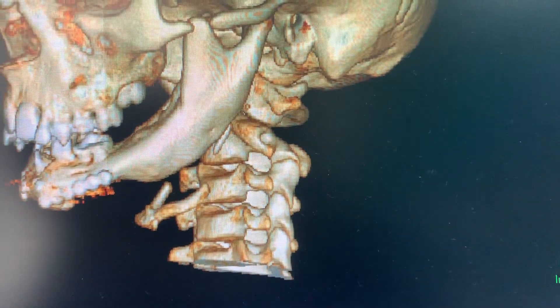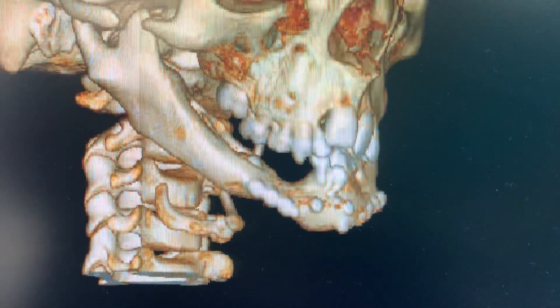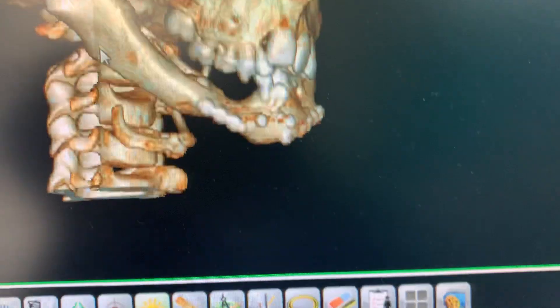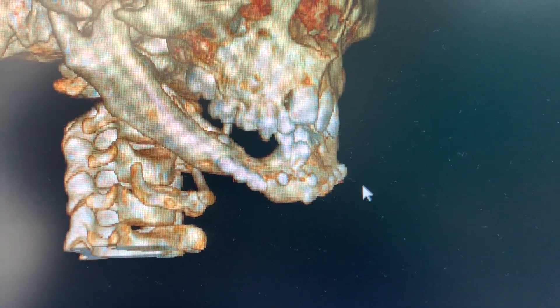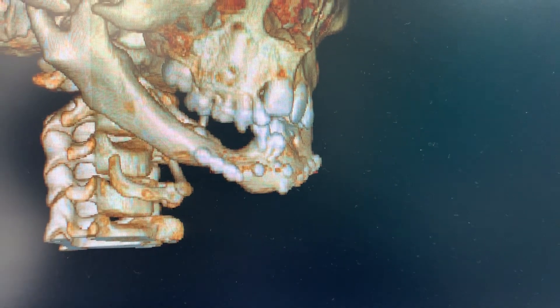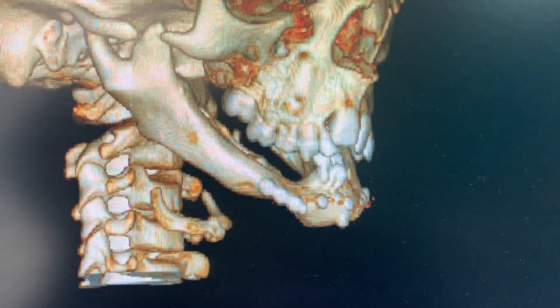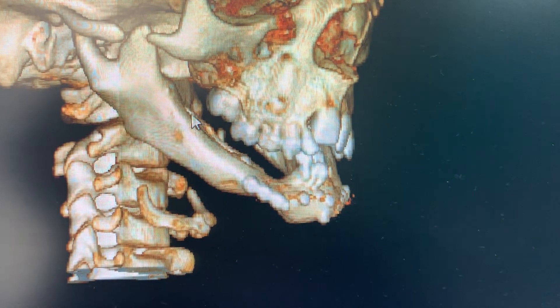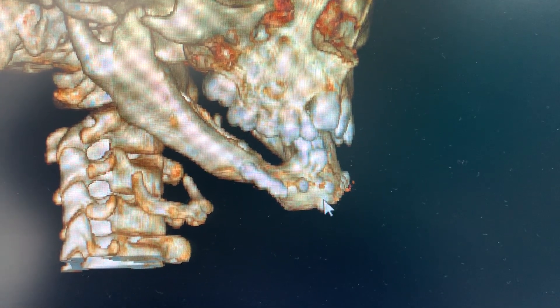I'm planning to do intraoral distractors. You can see how the coronoid and the condyles are, and the gonial angle is almost non-existent. These are the plates visible from some earlier surgery done by the patient three years ago. I'm planning to do an intraoral distraction osteogenesis to not only recreate some bone but also give a gonial angle, because right now it's essentially a straight bone.